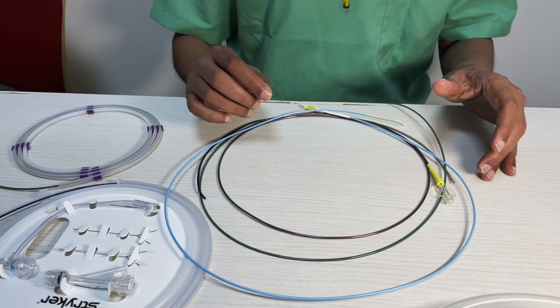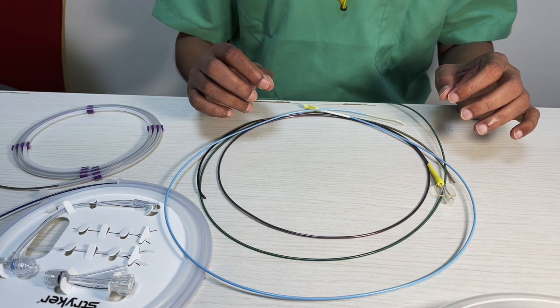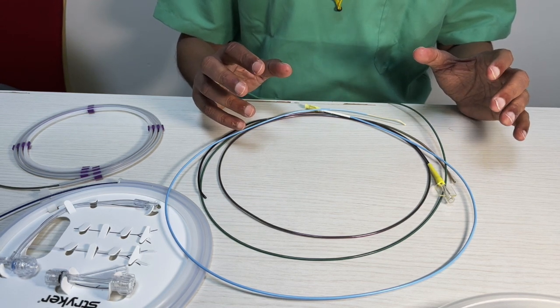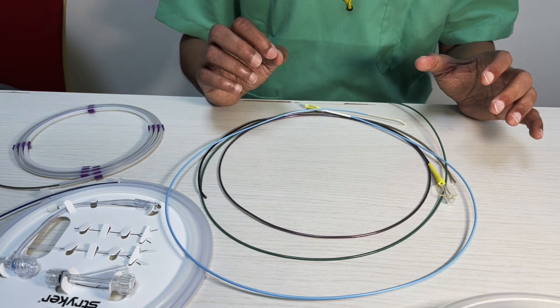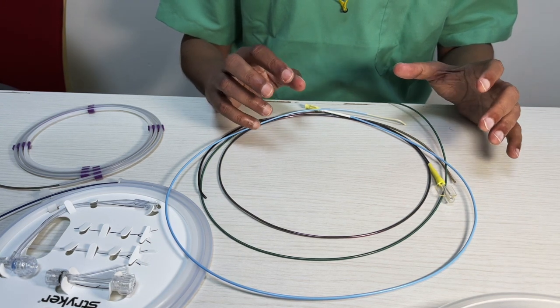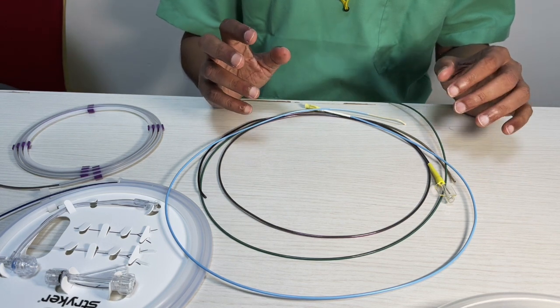So this morning, we'll try to understand a couple of devices which we commonly use in interventional radiology. Now, whenever we do a procedure, we understand one simple fundamental, and the fundamental is that the closer we are to the site of pathology, the more stability we get for the use of microcatheters and wires and devices.